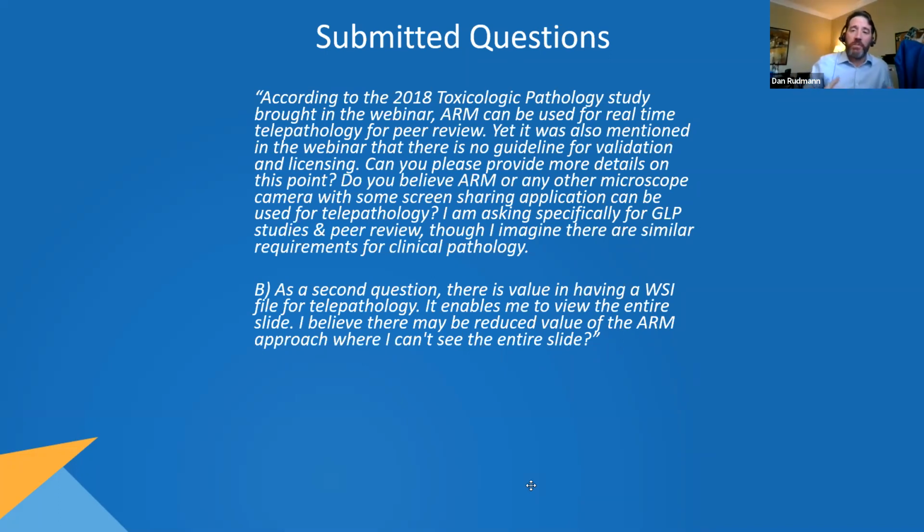We want the pathologists to make sure that they can rely on these tools that we're building for them, whether they be AI-driven tools or just literature. And so that's important. So the qualification will be very solid, but the GLP requirements are going to be different because it's not producing raw data.